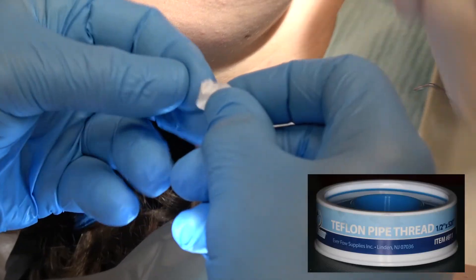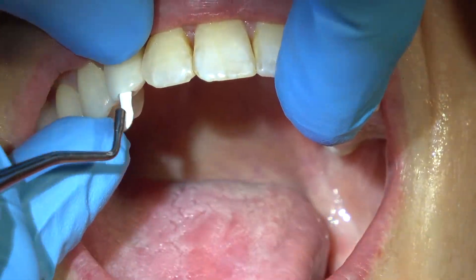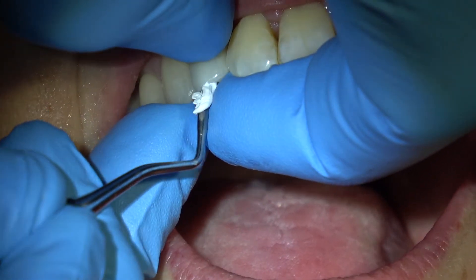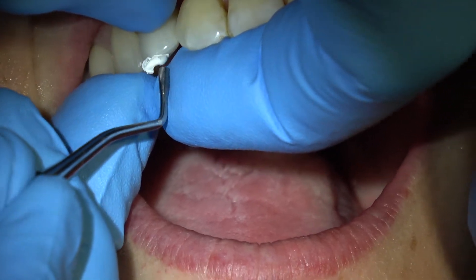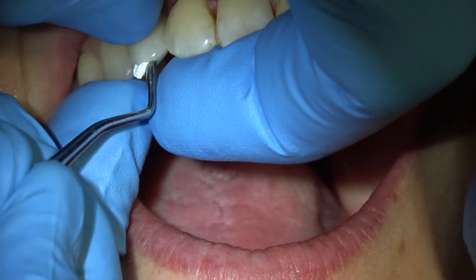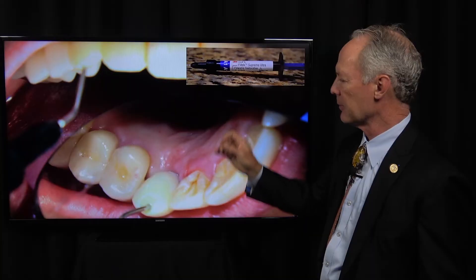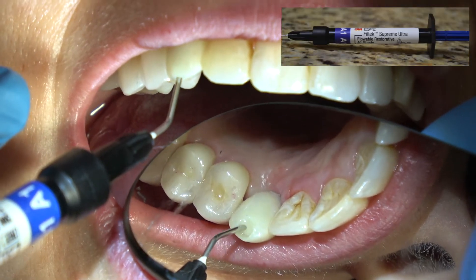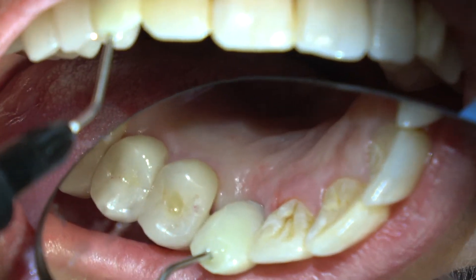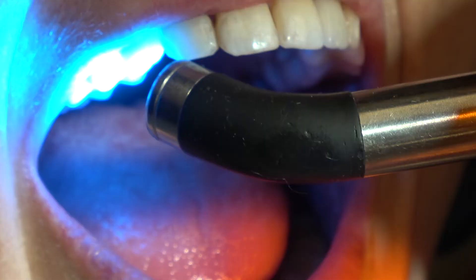This is plumber's tape, and we're going to place it in the orifice of the crown so you don't have a void in that orifice. If you ever had to unscrew the implant abutment and crown, this is easier to remove — you don't want to fill that entire hole with composite. Leave about a millimeter and a half of space for the composite. Now I'm flowing the composite on top of the plumber's tape, curing it, and polishing.